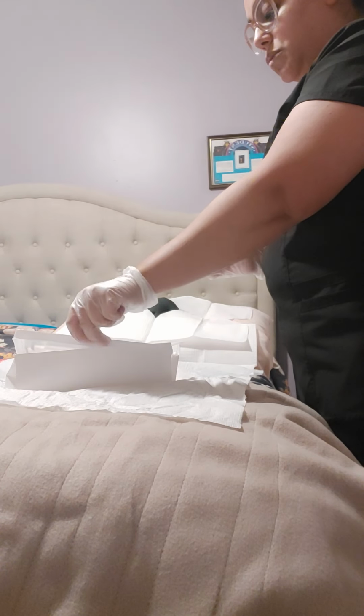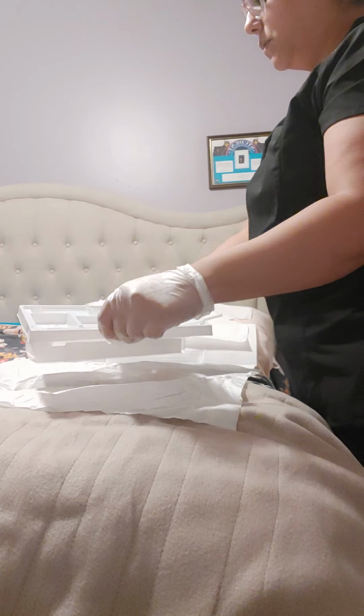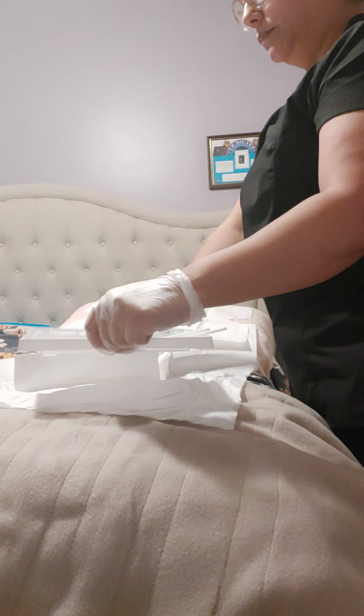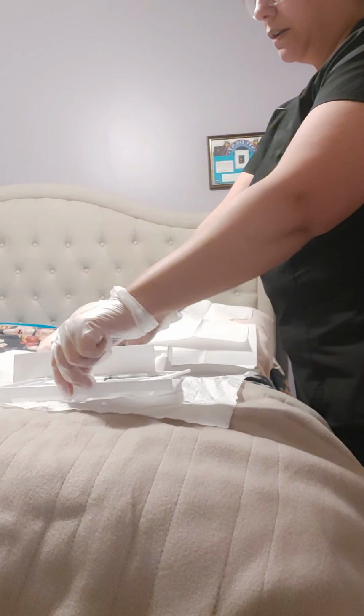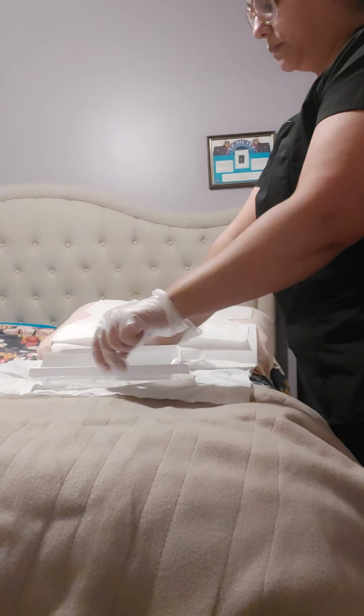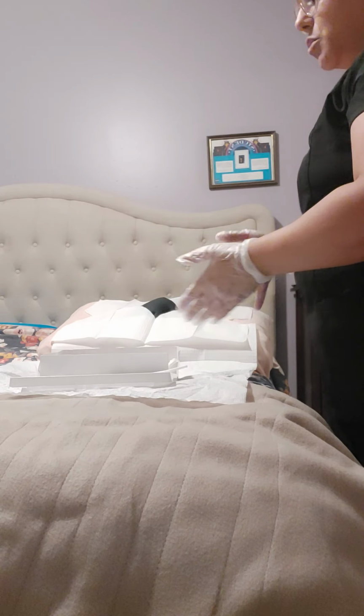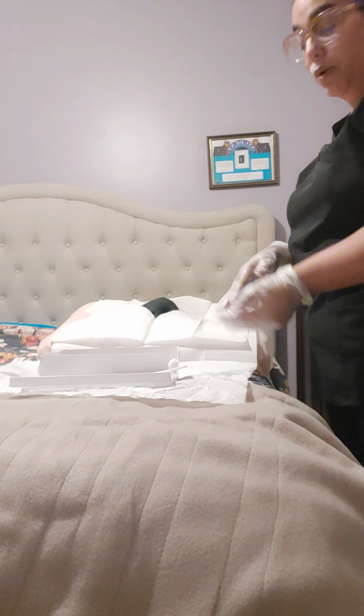I then like to pull this out. Move this over. I am putting my hand right in the center, pulling it over to put it closer in between my patient's legs, just because it gives you a better area and better angle to work with the patient without breaking sterility and having to turn around.